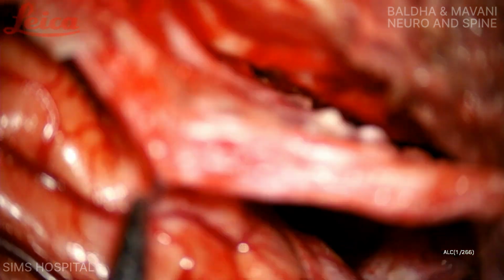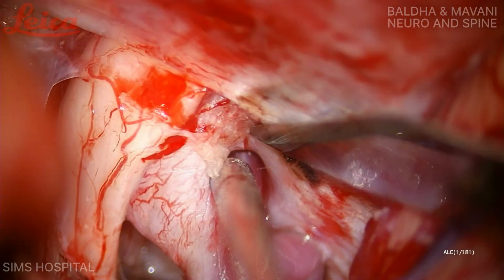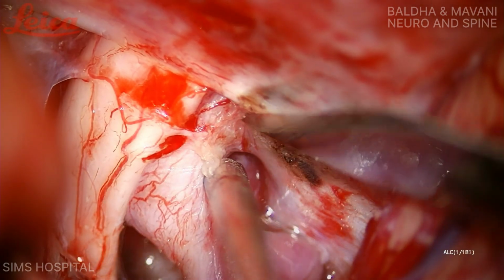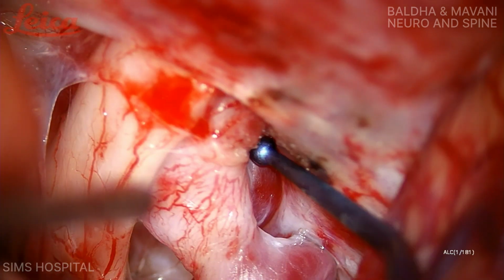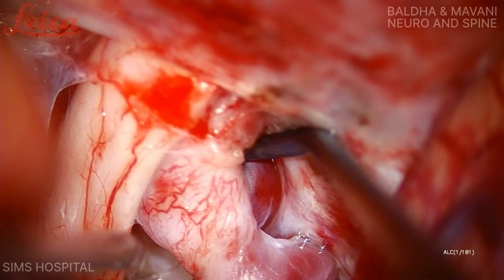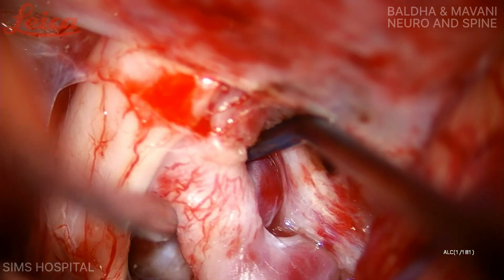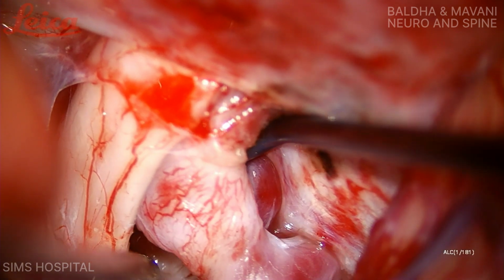Now I am switching to the intradural view. The dura near the superior dural ring is partially dissected with sharp cuts. As you can see, the proximal part of the aneurysm neck is now easily approachable. See the cherry red color of the dome of the aneurysm, which is due to the thinned out wall.